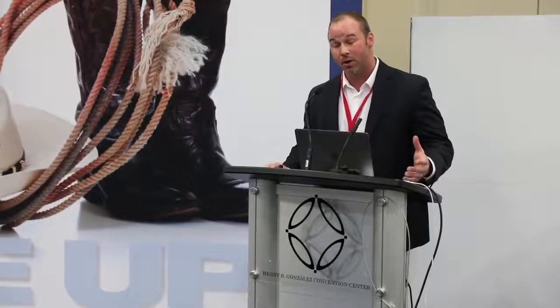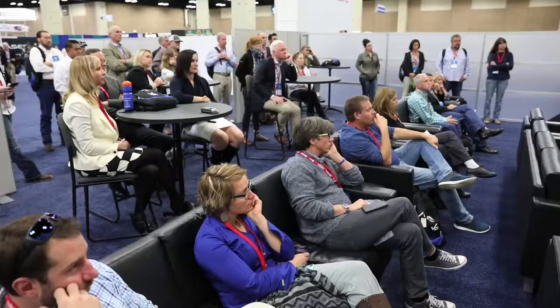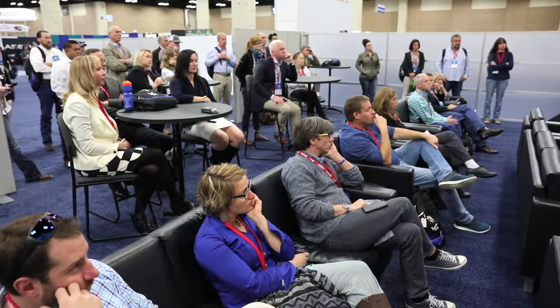And so this is a fan beam, which tends to show our bone, but our soft tissues a bit better than our cone beam. And our cone beam is a little bit limited by the physics currently in seeing the soft tissues. Also, our cone beam tends not to be able to use Hounsfield units, which is a differentiator in our soft tissues. So for instance, if I'm looking at fluid within the soft tissues versus a solid structure, that's a different differential diagnosis, and that is important to consider when looking at the two different technologies.